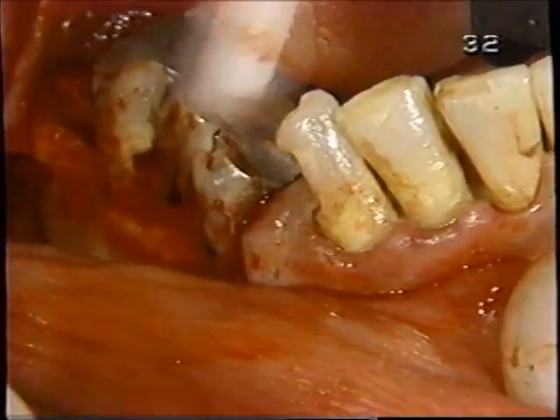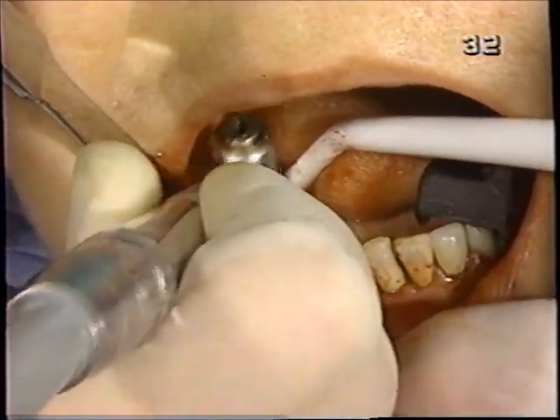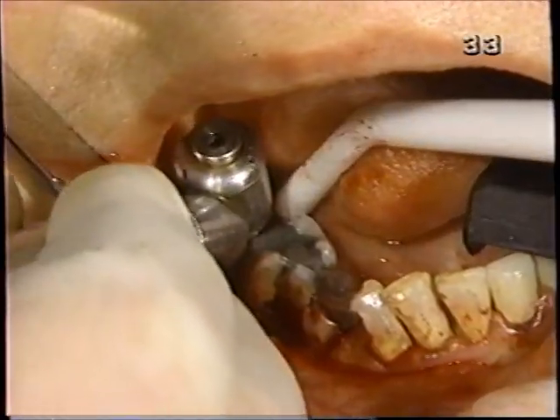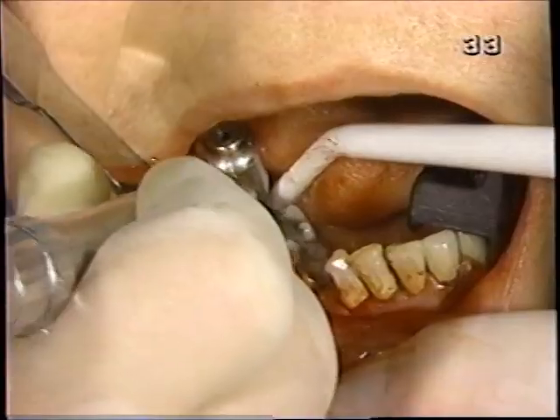Okay, all this to give us greater visibility. I'd rather not remove this bone if I don't have to. So let's use the burr to remove inter-radicular bone between the roots to lessen the body's hold on that root. Now I can put this all the way down to the depth of the socket of the other root and know that I'm not going any further than that, but I can go from that point mesially across a width that I would guess would be the width of the root.